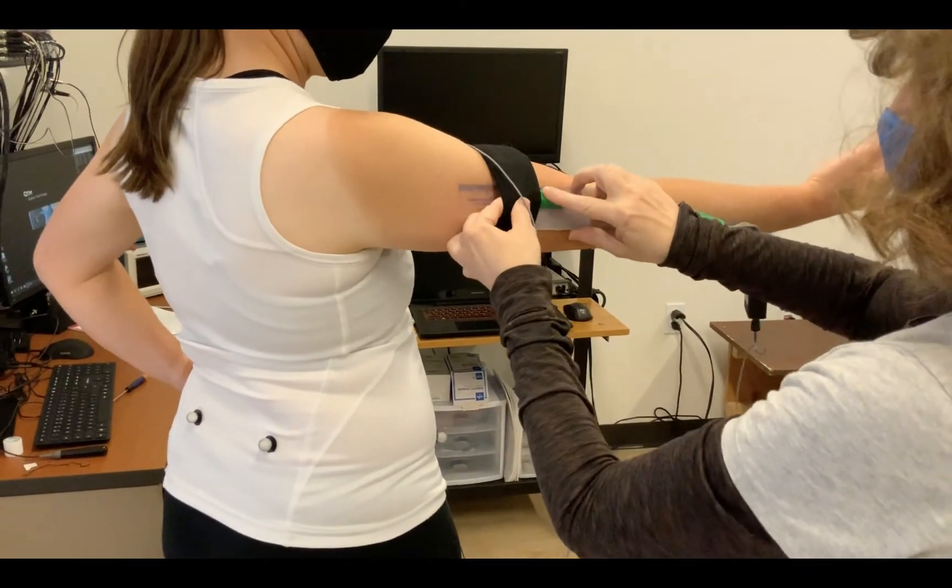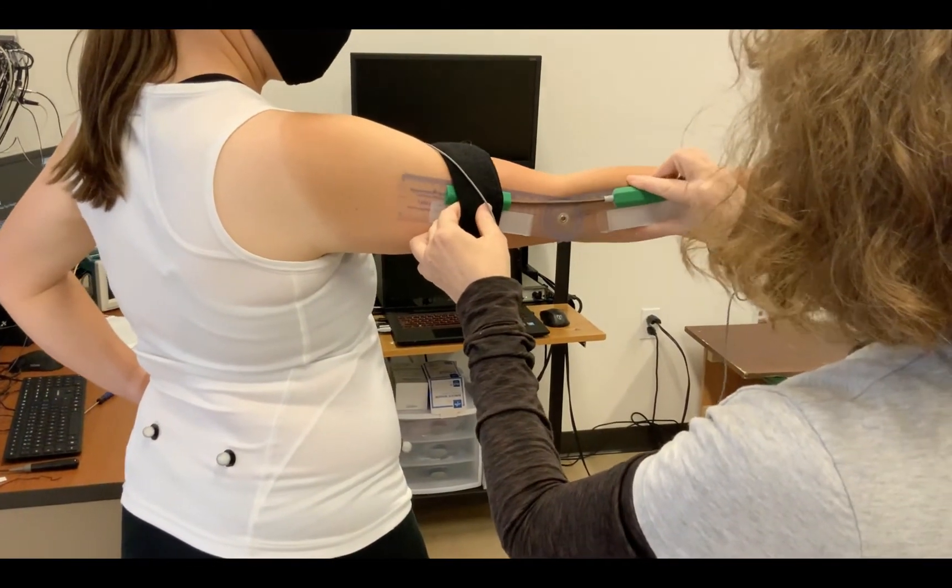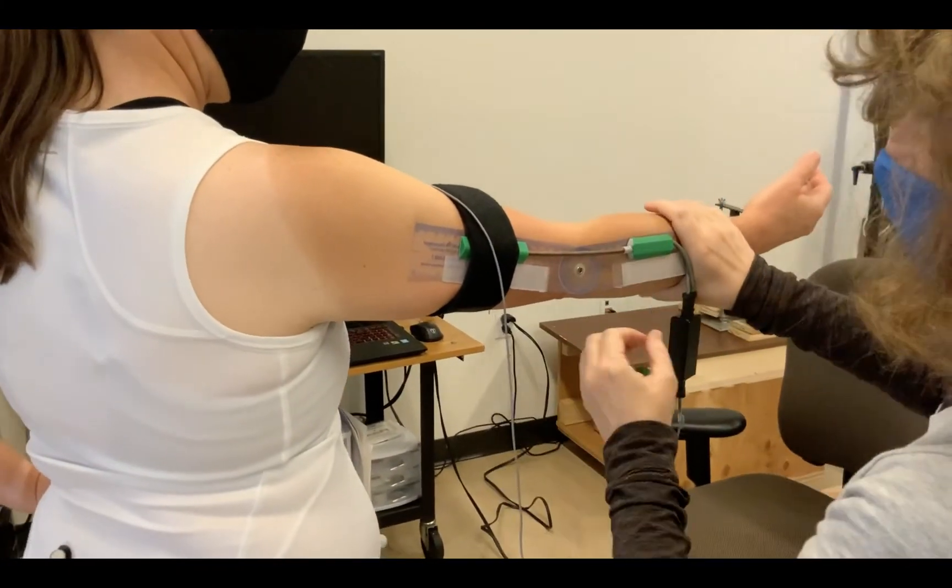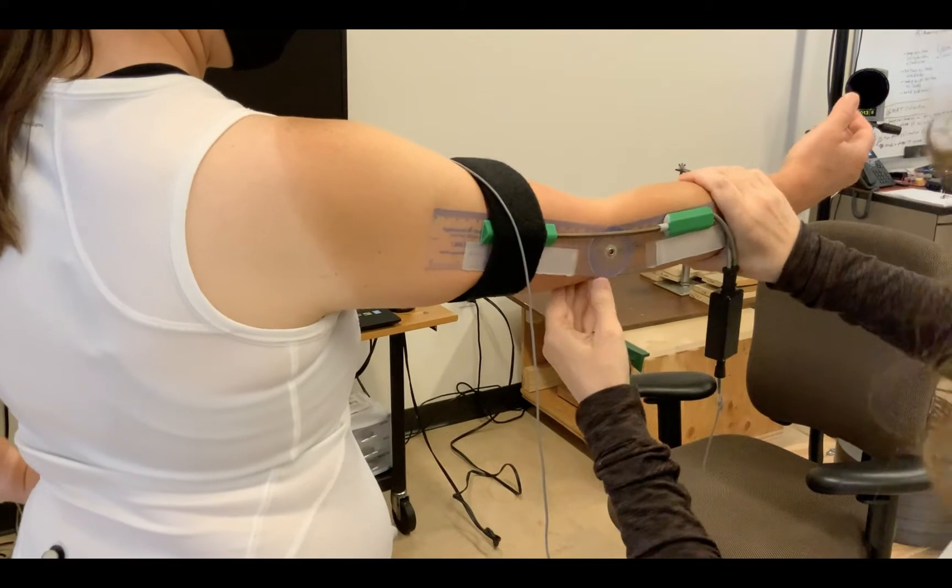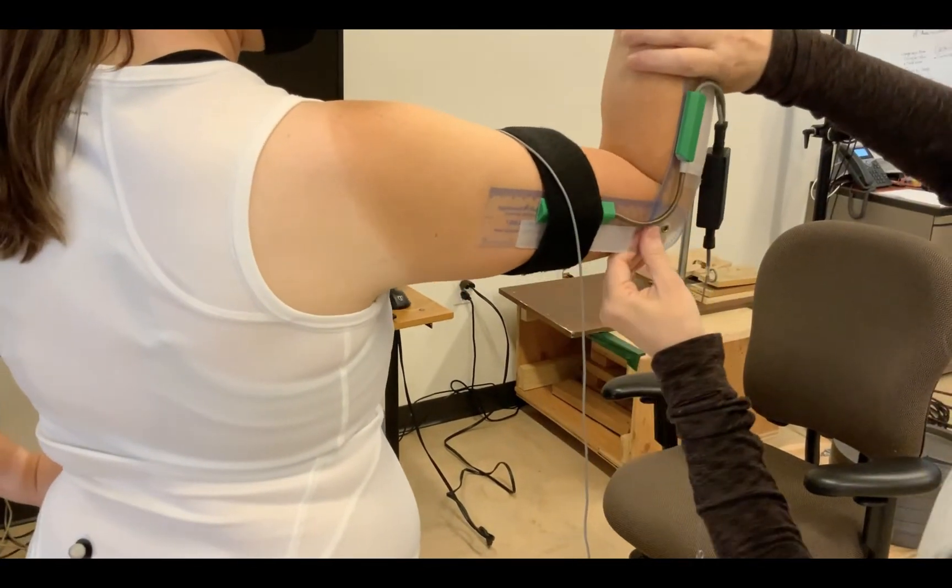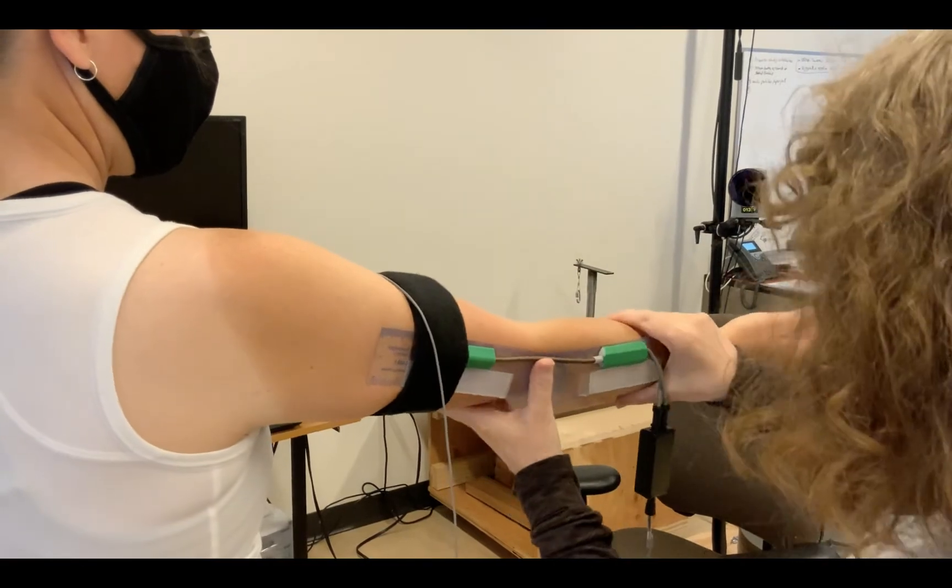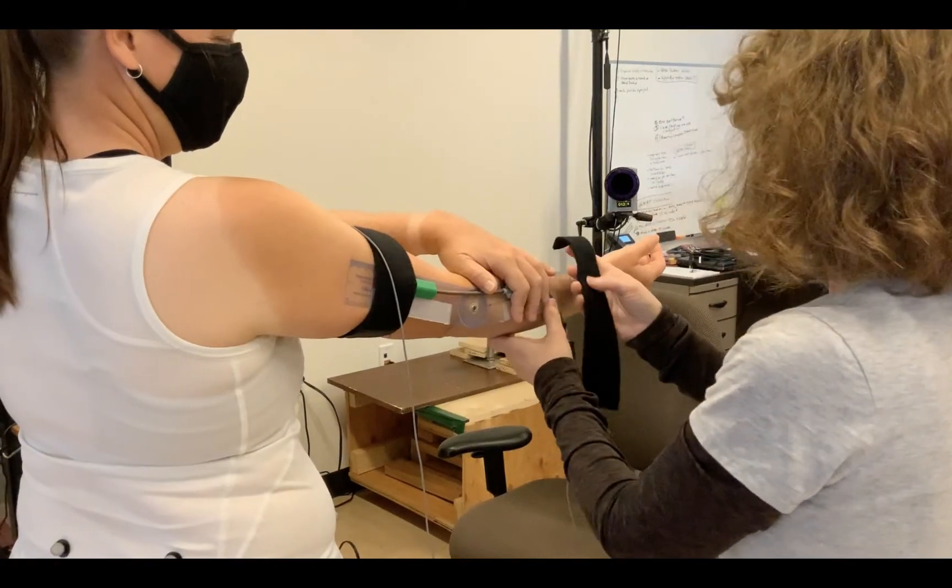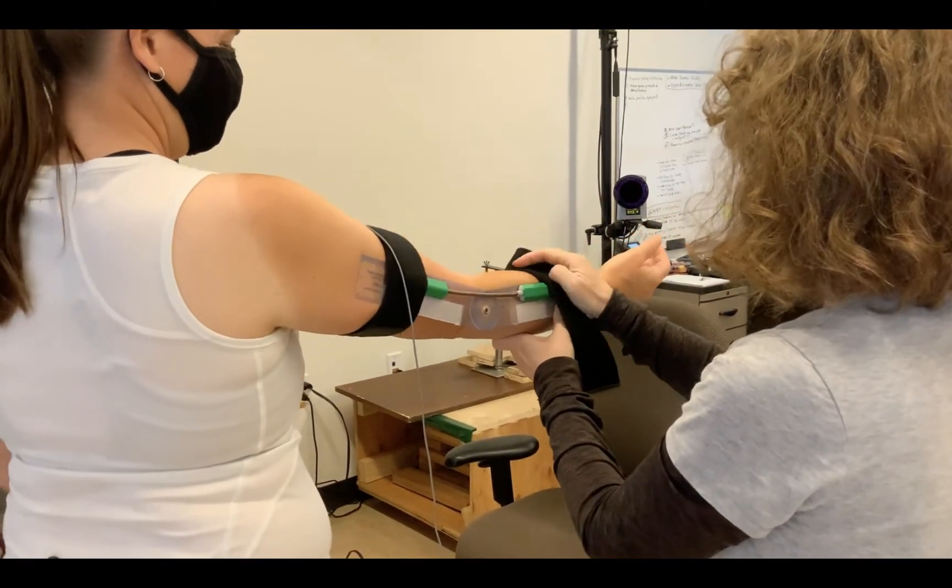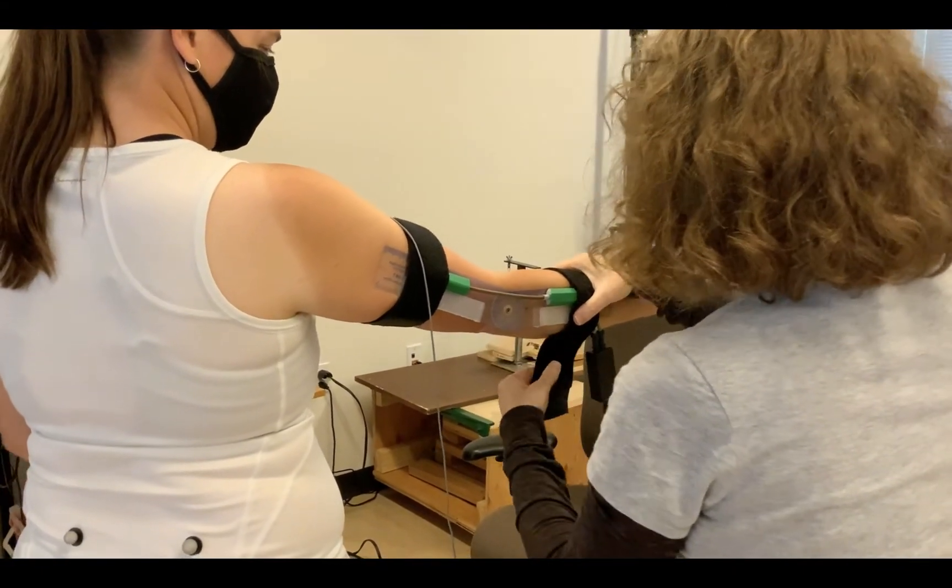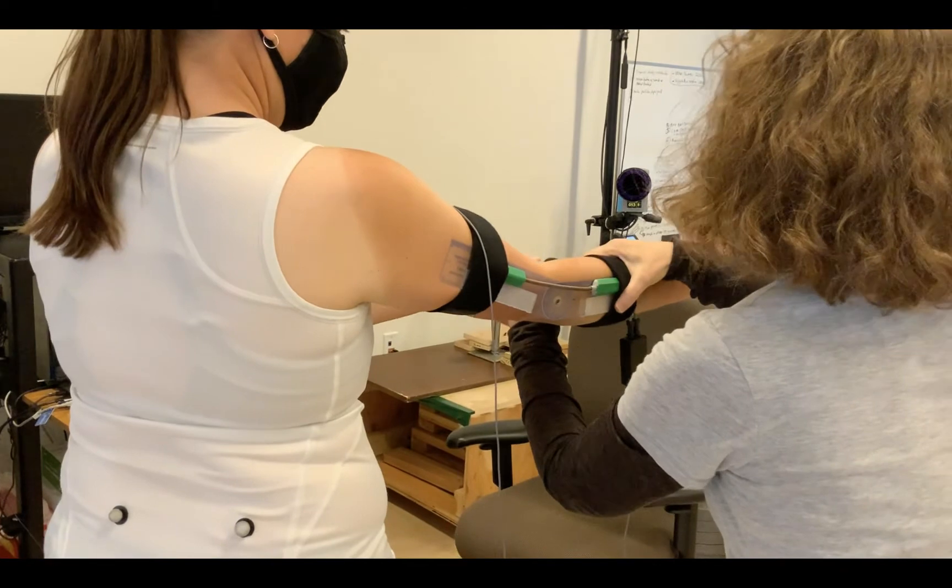Now we're going to attach a goniometer. When you're interested in muscle activity as angle changes, a goniometer is a way to measure angle. You can see that this bends with the subject and we're aligning it carefully with the elbow joint and we'll fasten it on there. This way we get data for angle as a function of time as well as the muscle activity as a function of time.